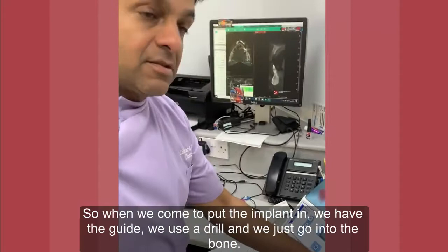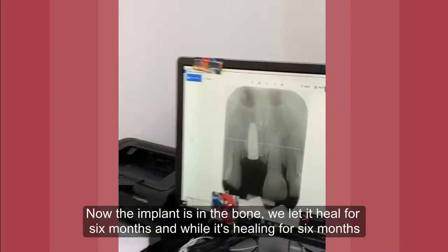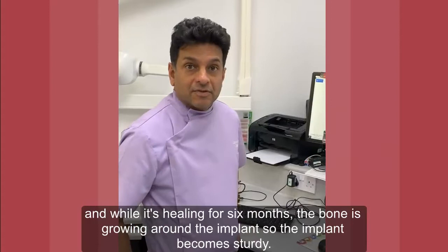Now the implant is in the bone. We let it heal for six months, and while it's healing for six months, the bone is growing around the implant.